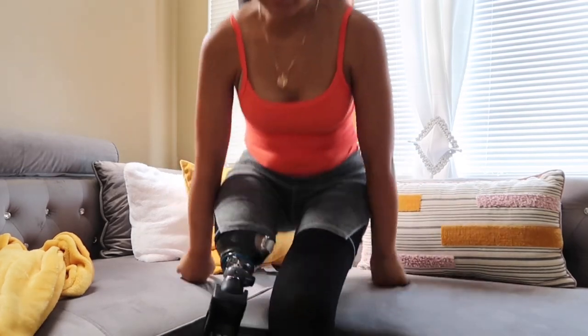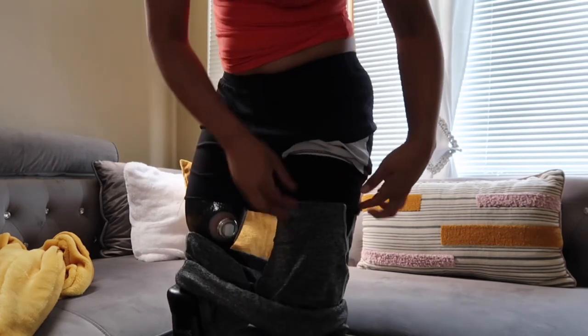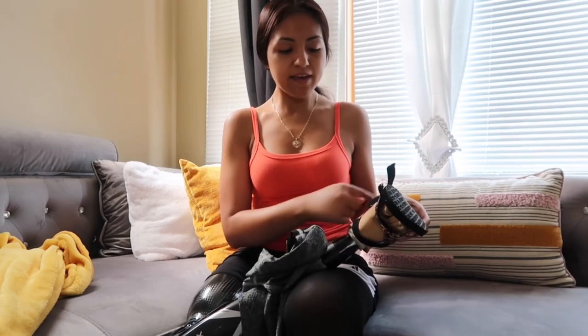Take my pants off, I'll put them back on. I have to use the rotator, so I'm going to show you. I have shorts under. So again, I press this button, press it, turn it. I'm going to show you if I have other shoes on, because these pants can go right through the foot.